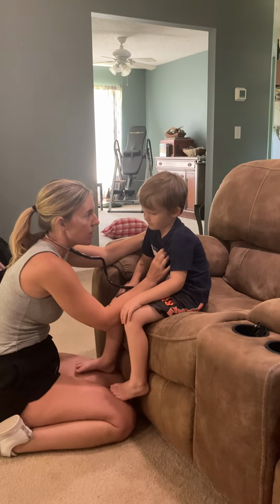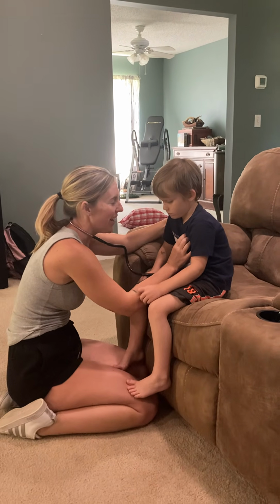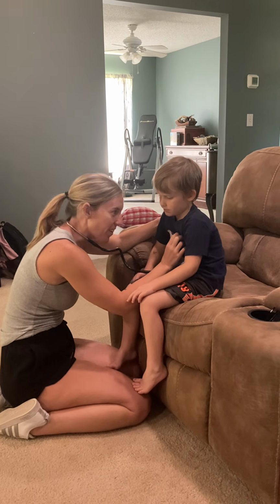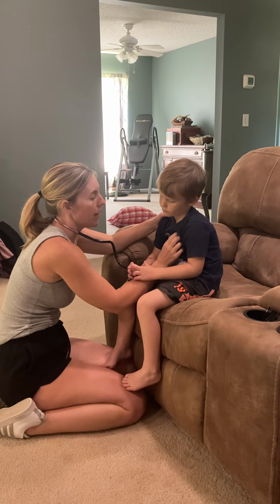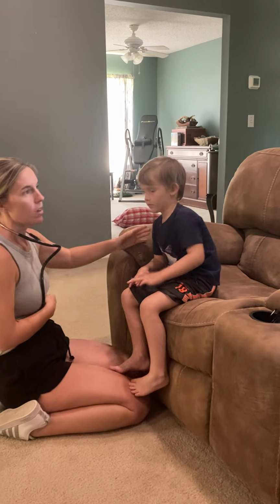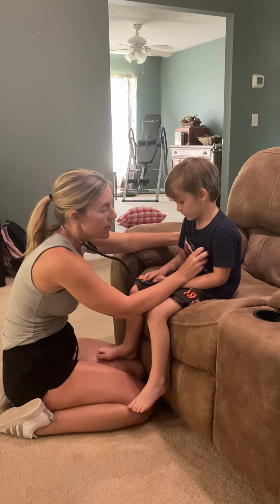Wait, no, pulmonic was the second. Erb's point is the third. Second intercostal space is the pulmonic. Third intercostal space is Erb's point. Fourth intercostal space is the tricuspid. And then when you go to the fifth intercostal space, you go mid-clavicular, and that's the mitral valve.